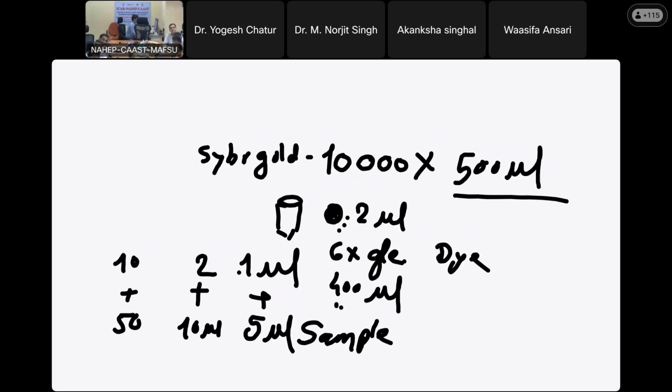It has only 4 components. You can make your own dye in milliliters and use it. I don't think there is a need to spend money on this fancy stuff. You can save that money and go for NGS or something other good.